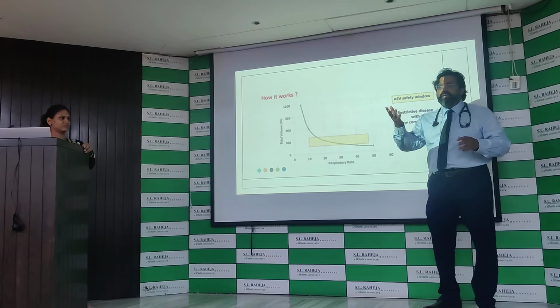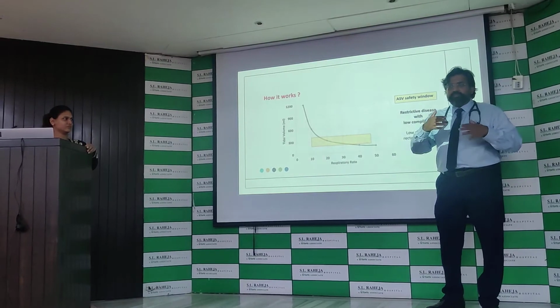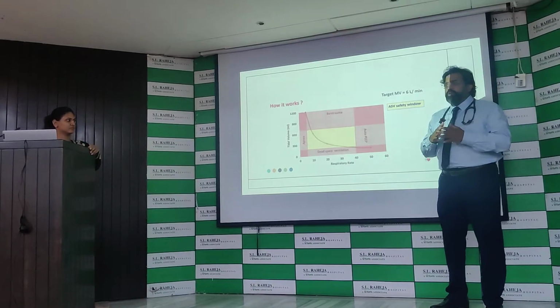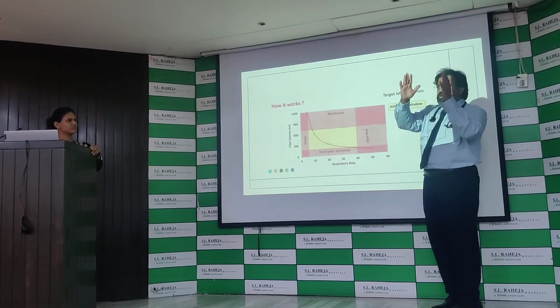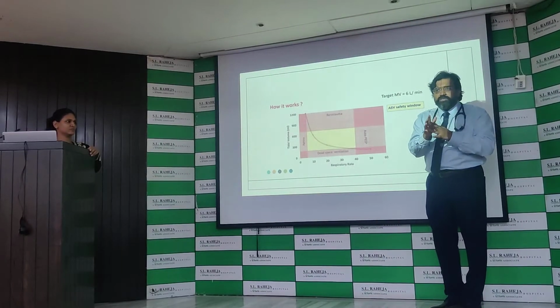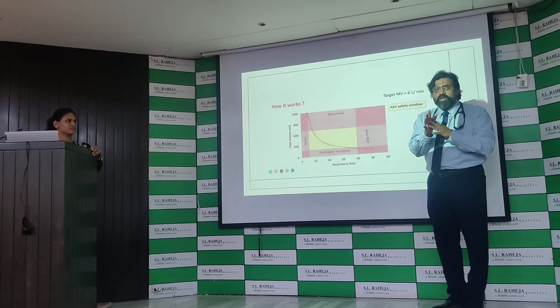Meanwhile, if a patient suddenly has bronchospasm, a tremendous bronchospasm, then what will happen? It will again go back. It will go back to that obstructive window, and it will try to compensate for that. It will not allow this patient to be in a wrong zone.